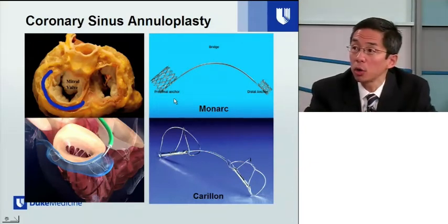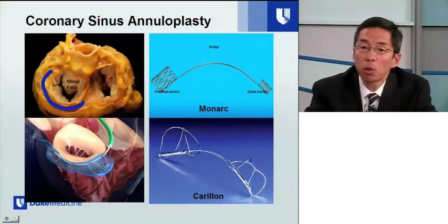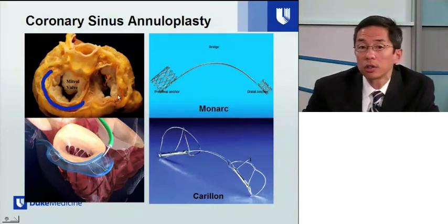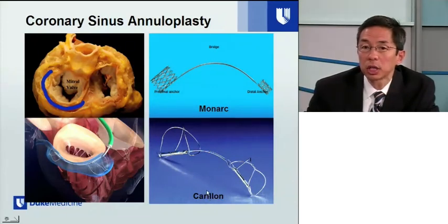As we move toward talking about other percutaneous devices for mitral valve repair, it's important to recognize that the surgical approach to functional mitral regurgitation entails an annuloplasty device in which a ring is placed around the mitral valve to reduce the orifice size of the mitral valve. And as you can see here, there are devices that are being developed that are intended to go into the coronary sinus that mimic the mitral annular devices to reduce the orifice size of the mitral valve. This is one of the devices developed by Edwards, the Monarch device, and this is a device developed by Cardiac Dimensions, the Carillon device. You see the very similar structure of two fixation devices in the coronary sinus, as well as a tension mechanism that shortens to reduce the anterior-posterior diameter of the mitral valve.